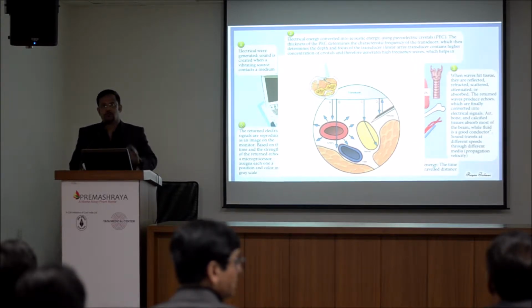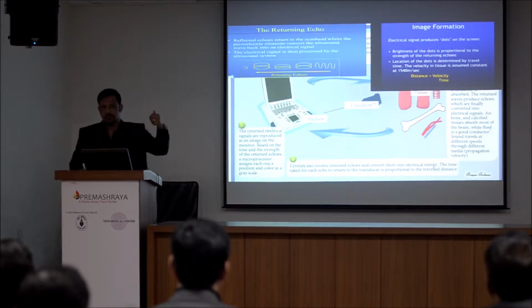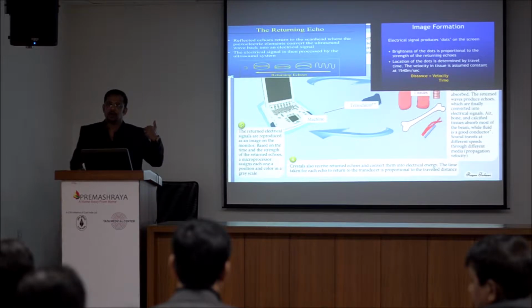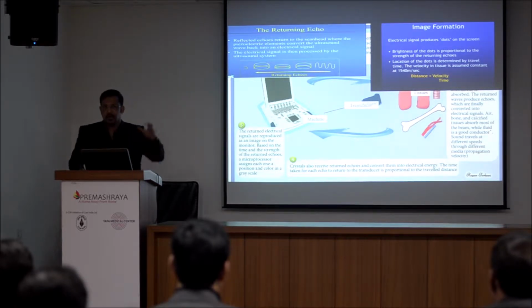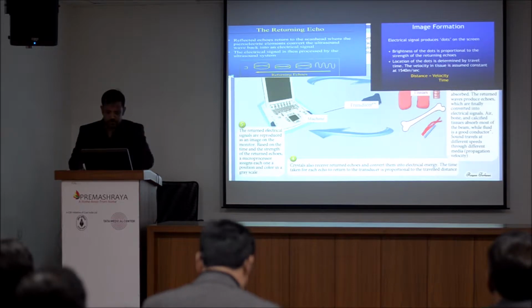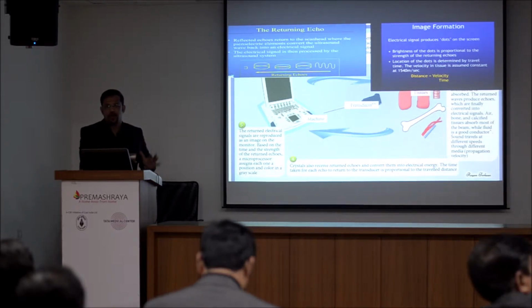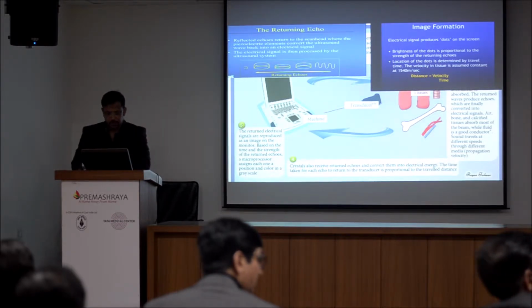Now the amount of wave which returns back to the transducer, the probe, is again converted by the piezoelectric crystal into electrical energy, and depending upon the intensity of the wave coming back, it is depicted as dots on the screen, and that is what you see on your monitor. So this is briefly how an ultrasound wave is created and how you see it on the monitor.